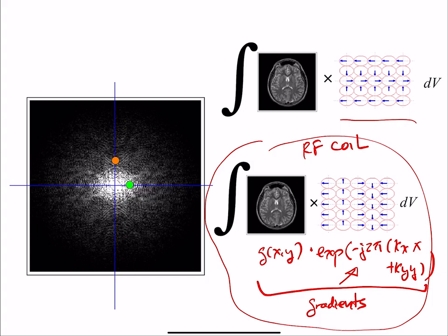Right? Could you say that again? The last bit, after taking the integration? Yeah, so basically we apply the gradient, which imposes a spatial pattern. The RF coil sees everything, so it's essentially integrating. That signal goes into our amplifier, and then we digitize it, and put that number into the computer. The amplitude and phase, actually. We won't get into details right now, but we actually store the real and imaginary numbers. So, it's sort of interesting.